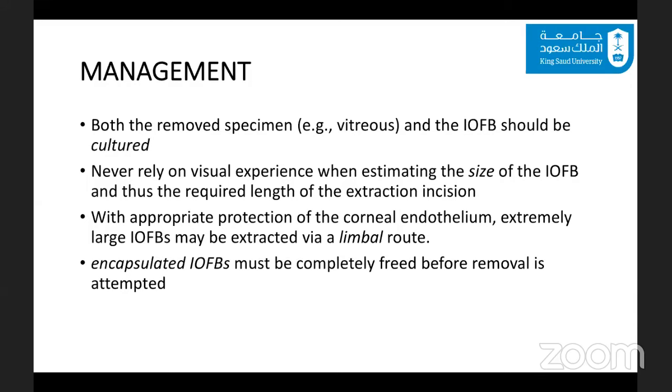And as Dr. Bargi mentioned, we need proper protection of the corneal endothelium when you are considering a limbal route for extraction. And for encapsulation, the foreign body should be freed from the encapsulation, and first freed from the vitreous attachment. Plus, for the intraocular foreign body magnet to work, it needs direct contact with the metallic foreign body itself.